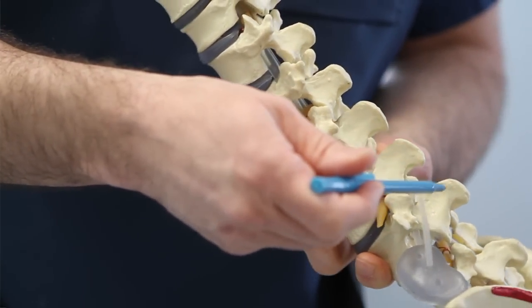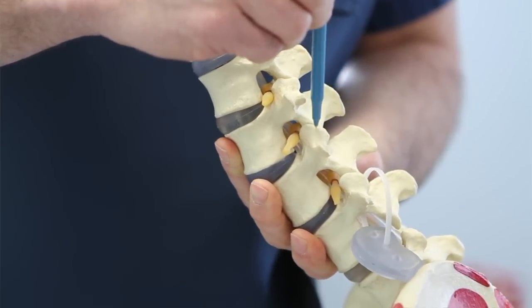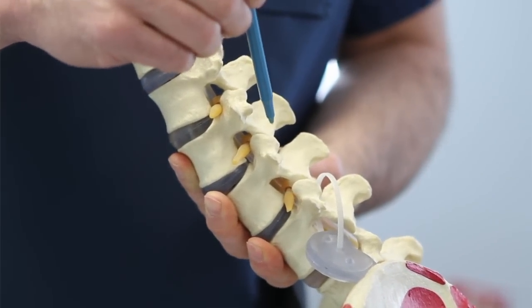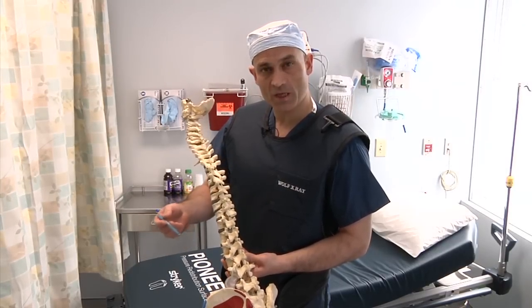This is the back of the spine. These are the spinous processes. These are the lumbar facet joints which provide stability and motion to the back of the spine. It is these joints that when degenerate can cause lower back pain.